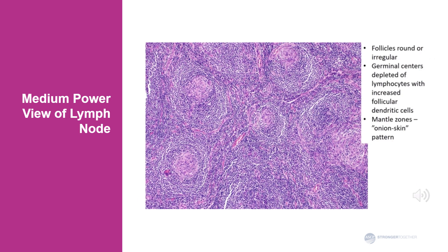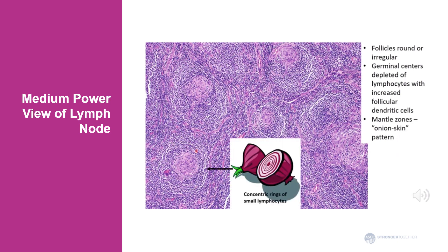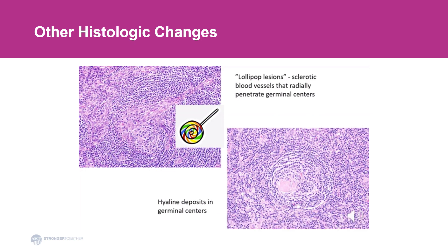This is a medium power view of the same lymph node, and it shows mostly follicles which are increased in number. Follicles can be round or irregular. Germinal centers, which are in the center of the follicles, are depleted of small lymphocytes and instead have increased follicular dendritic cells. Mantle zones, which surround the germinal centers, show a so-called onion skin pattern — concentric rings of small lymphocytes reminiscent of an onion when cut in half. Another helpful feature are lollipop lesions, which are sclerotic blood vessels that radially penetrate the germinal center, reminiscent of a lollipop.